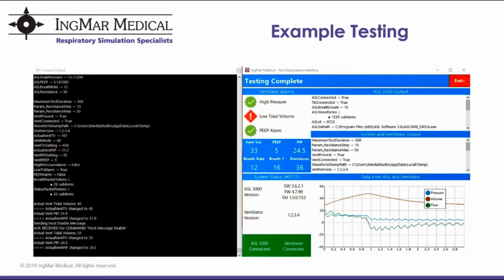Sure. So when you issue the OA command and complete a connection, you'll see a prompt that says ASL and either the serial number or a COM port. When you want to connect to a second and third and nth ASL, you would use what's called the SA command. And the SA command allows you to connect to an ASL separately and then determine which ASL you're driving. So the SA command is the two-letter command that allows you to do that.